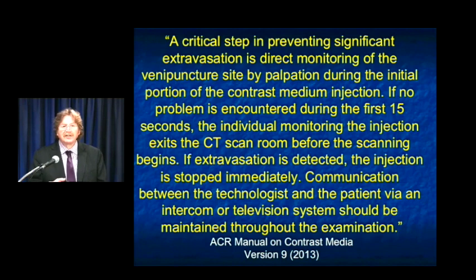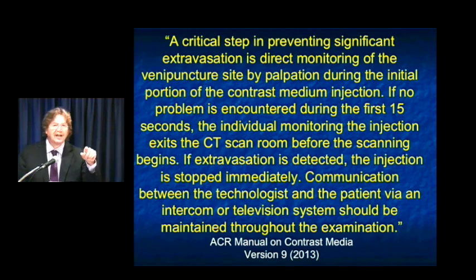You only know the patient extravasated when you don't see contrast in the scan and you come out and they got a big bump on their arm. So to us, it's very critical. Communication between the tech and the patient is critical. We do not have our injector boxes and our MedRad injectors in the scanning room where the technologist sits and does the scanning. The boxes are next to the patient. We want the tech to be out there with the patient when the injection happens.